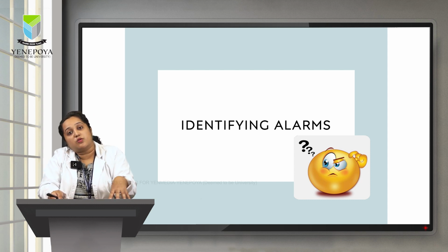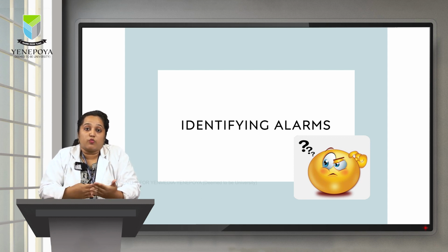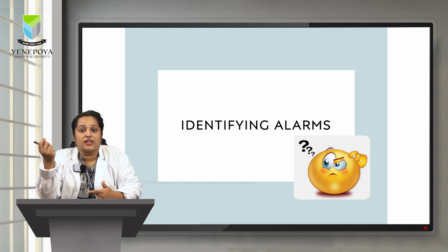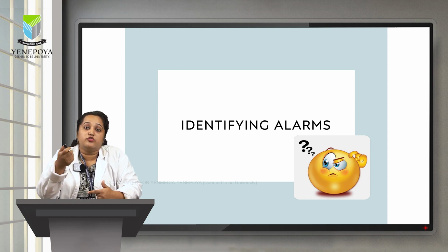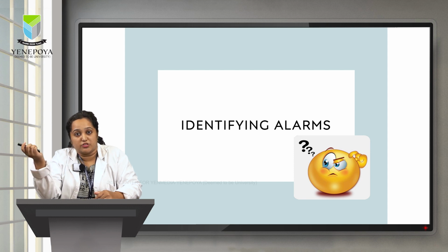Now we have discussed the various ventilator related problems and the patient related problems. This is when you go and see what needs to be done. Before this, there is something also known as alarms. Usually when you see a patient who is in distress, who doesn't look fine, definitely that patient will have tachypnea, tachycardia or desaturation. But also there will be constant alarms in the ICU setup, right? Usually what we do is go and silence the alarm. But the correct way is to go see what the alarm is about and try to troubleshoot it, right?